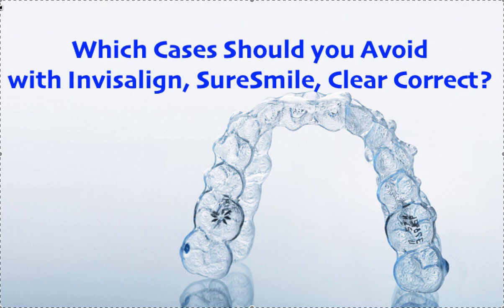Unless you fix the underlying etiology, which might be surgical, it might be related to OMT, it might require a habit appliance, you do not take that case, okay, until it's fully fixed, which may not even be possible if it's not a growing child. So for that reason, I just say don't take them. Not even a little one. It's a no, okay?